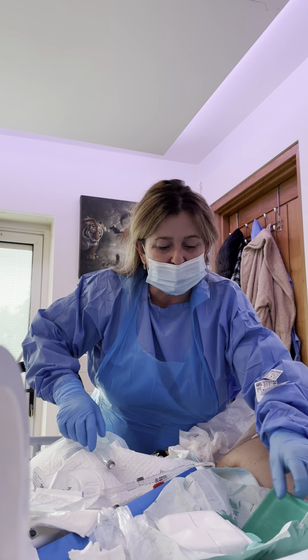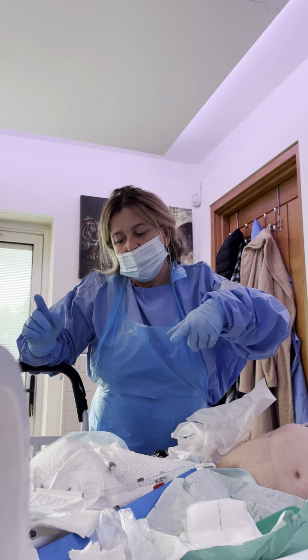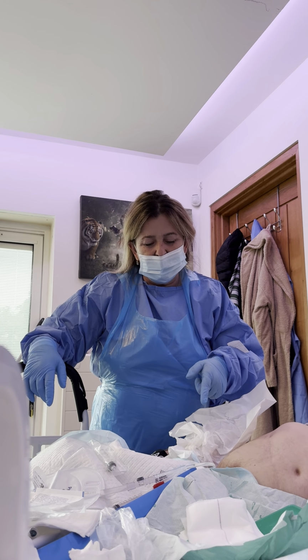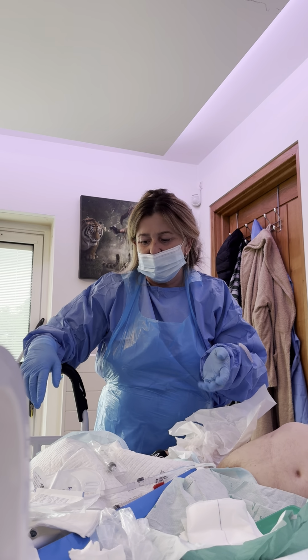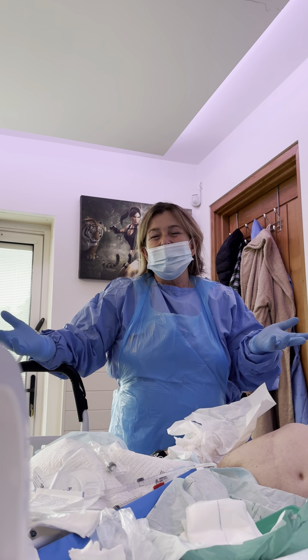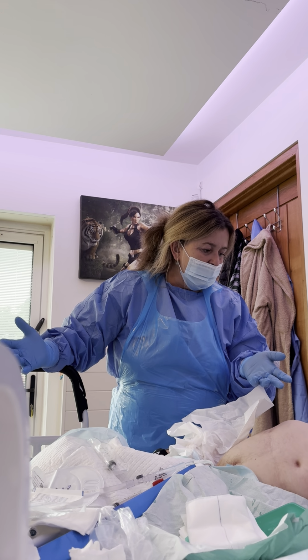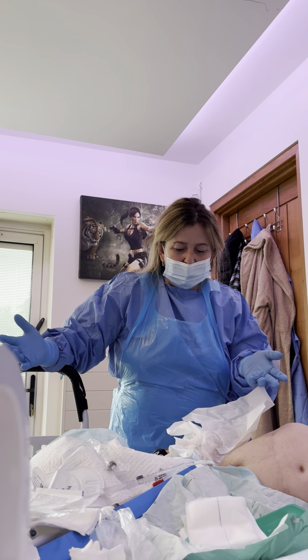So what I'm going to do is draw up some saline and put it in there, but I want to show you this is a perfect catheter. It was due Monday, like I said, and it's Friday today, so it's a couple of days. Did it have stuff in it though? Absolutely nothing in there.